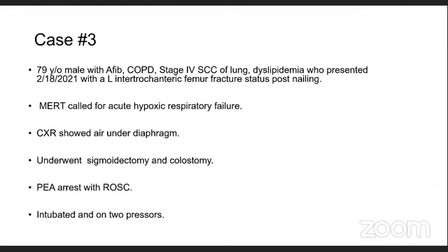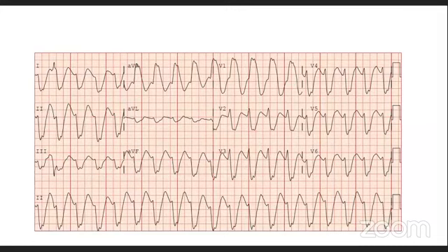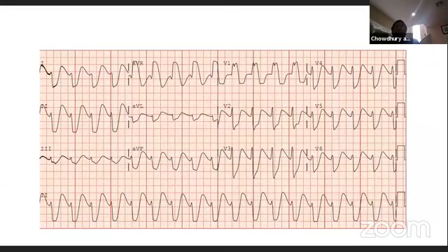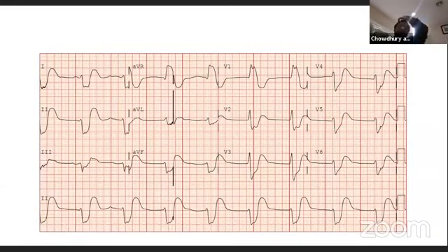Hafiz bhai, is it possible due to tricyclic antidepressant overdose? First of all, to start with, tricyclic antidepressant is out, because tricyclic antidepressant usually comes with tachycardia, not with this. But hypoxia, acidosis, bradycardia, wide complex, the start point is a very important clue.